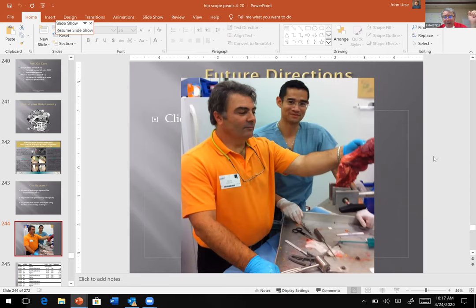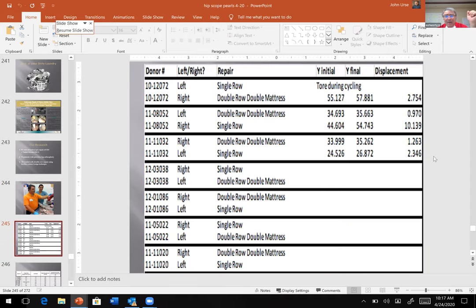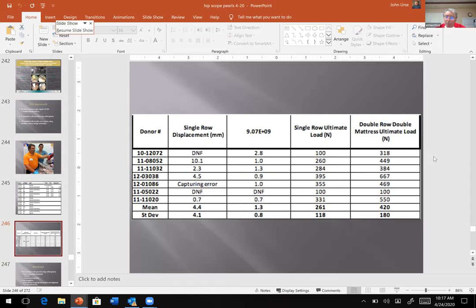We've done some Biodex studies. That's my buddy Viet Nguyen. And we took Instron machines and pulled on these with single and double row repairs. They had a single row on one side, double row on the other. And we looked at the pullout strength. We were talking about newtons of strength. If you look at the single row newtons and the double row newtons, we had probably 25 cadavers. Ben Dome did some of these and I did some. I submitted another paper on this saying, here's the pullout strength.